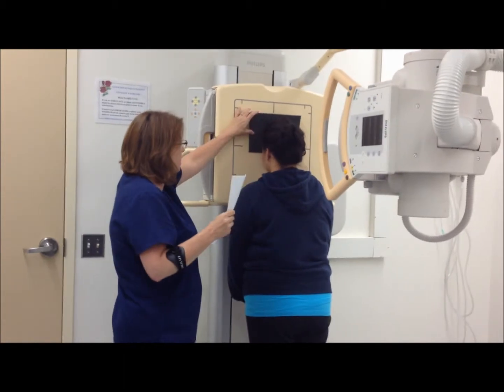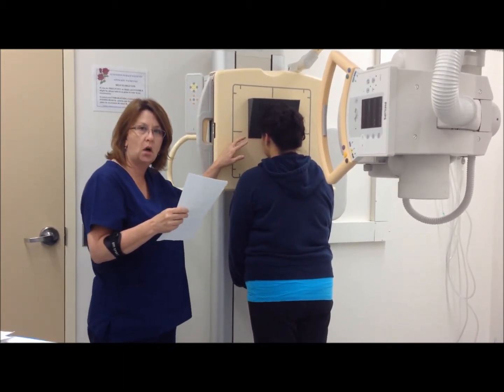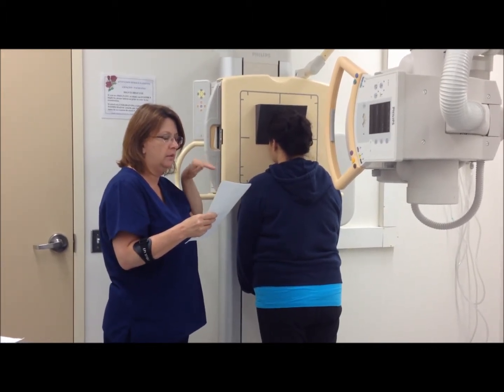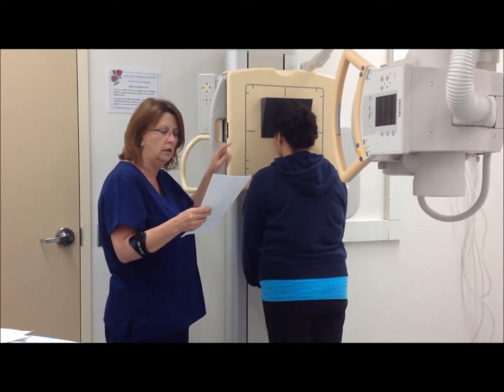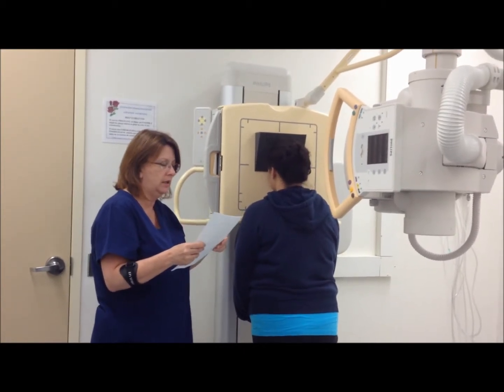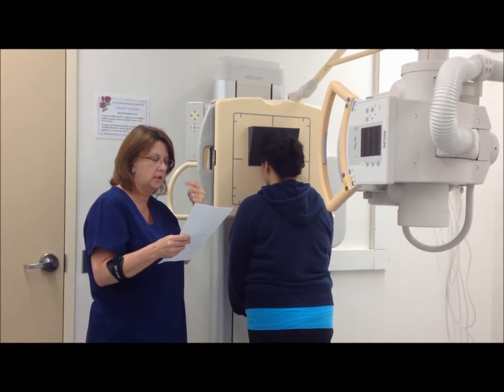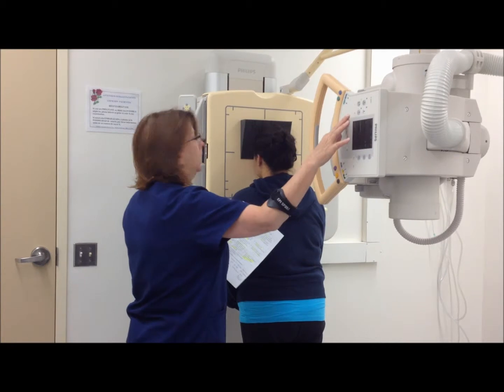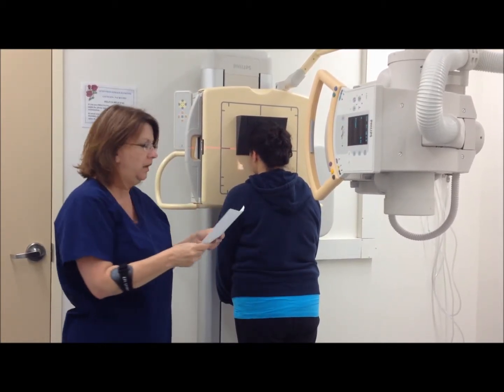Okay. So what I'm going to be doing here is lining up the OML 15 degrees off of the board. The CR is going to enter horizontally and exit the nasion. We're using an 8x10 film, and the area of interest we're looking at is the frontal and anterior ethmoid sinuses here. Wind up to her nasion.